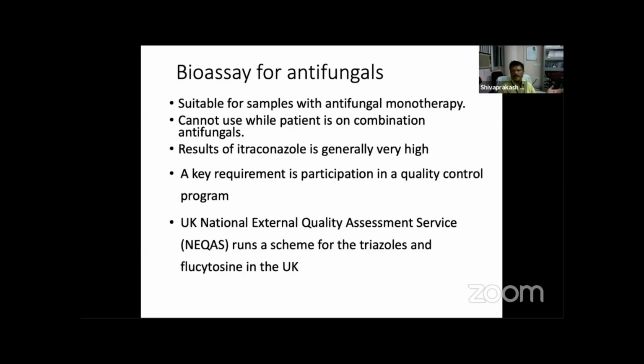If the patient is on voriconazole and caspofungin also is added as a combination, there will be added inhibition, so you will not get the correct voriconazole levels because the zone diameter will be larger because of the effect of caspofungin. In HPLC, the peaks appear at different places in the graph, so it can clearly differentiate the caspofungin level as well as this one.